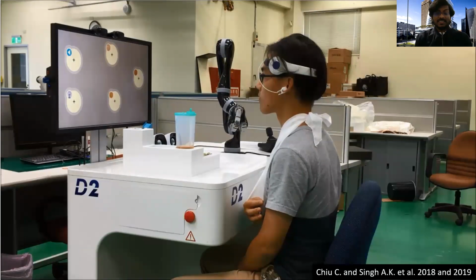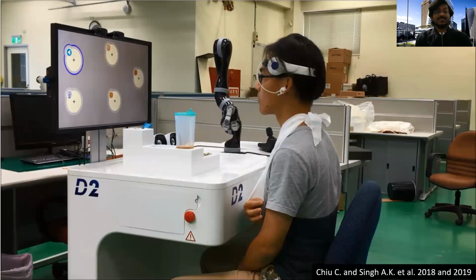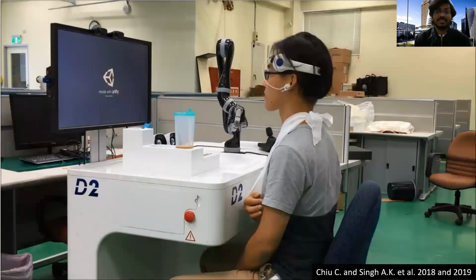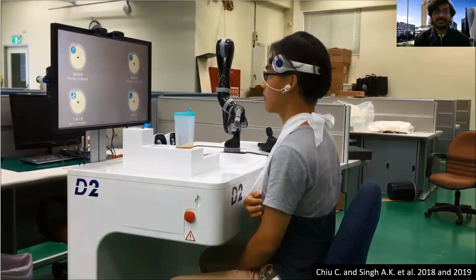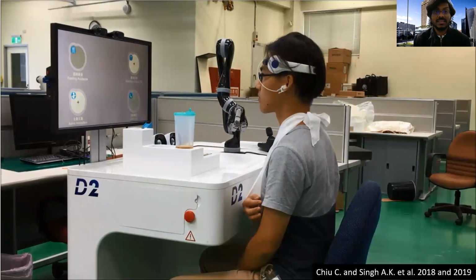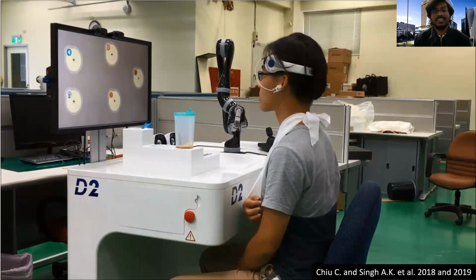But this is an example showing what is possible with one simple SSVEP paradigm. We also have some other options of entertainment where you can choose different choices. So again, he's choosing the feeding option. Maybe he's very hungry.